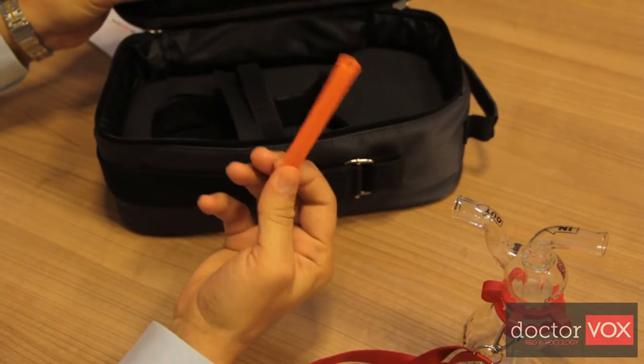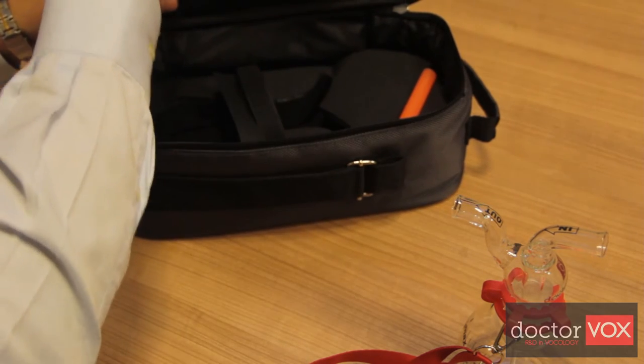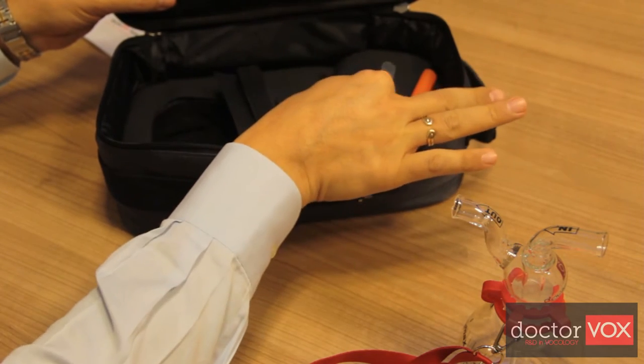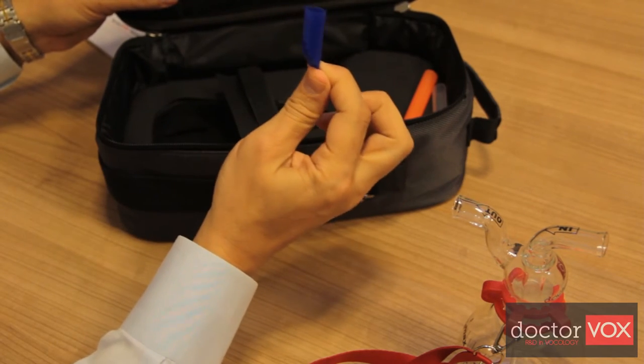The set also includes a silicone mouthpiece for phonating, a silicone mouthpiece for inhaling, and a silicone tip tuner.